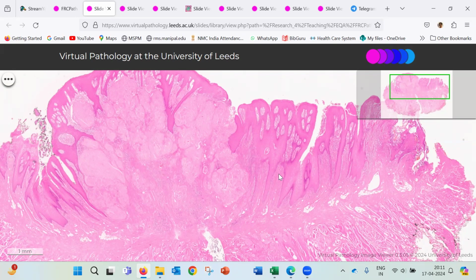And see that amyloid is repeated almost every alternate session. So either in spring or autumn, every year they have an amyloid case, and this is the particular case.